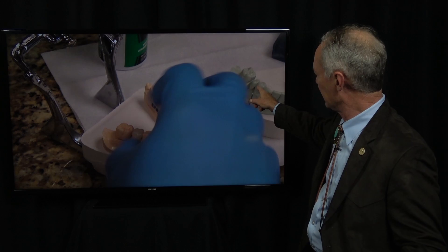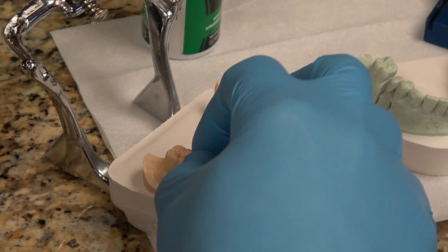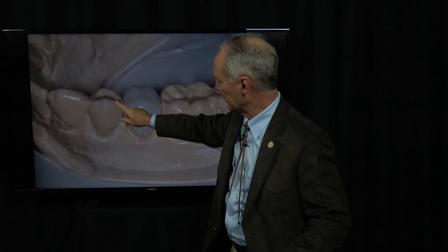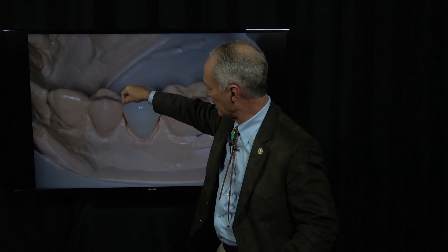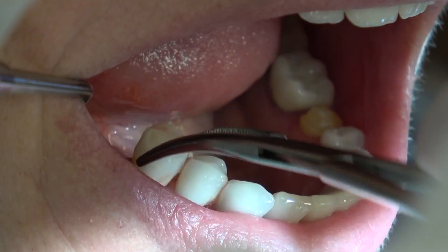Here are the crowns coming from the die model, and then we're trying them on again on the stone model. What I've done is I've colored the interproximal part of the stone model with a pencil and then very gently scraped it off twice, and that makes it just a little plus when you place your crown.